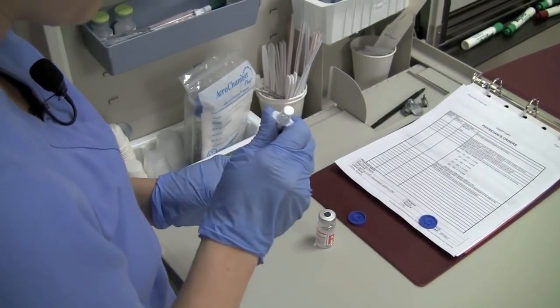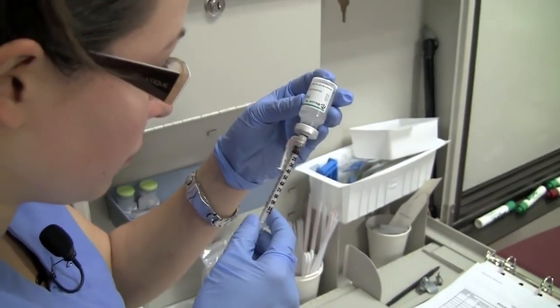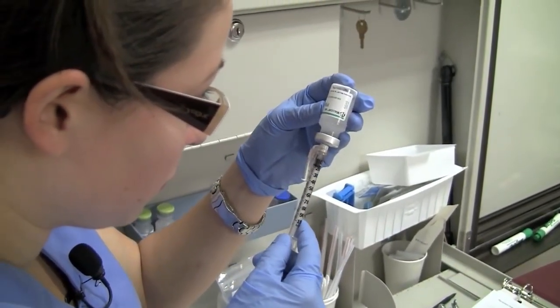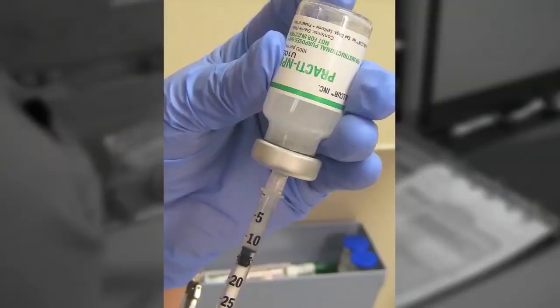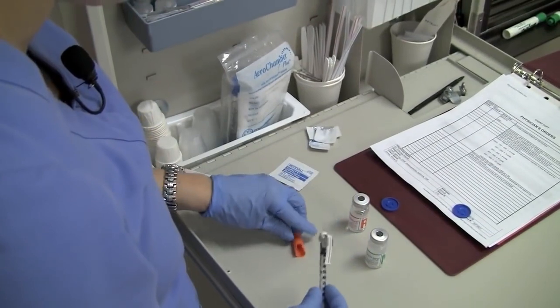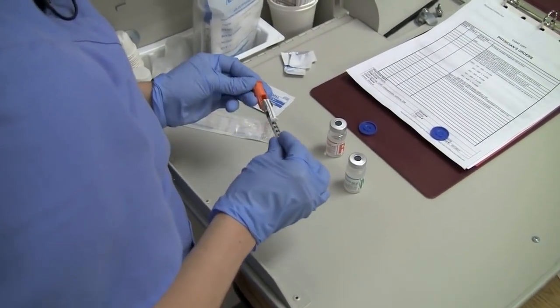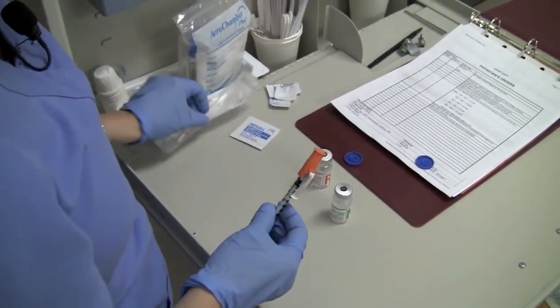Reinsert the needle into the NPH vial and withdraw 30 units of NPH. Be careful to withdraw only the ordered amount. If excess medication has been withdrawn, discard the syringe and begin again with both insulins. Withdraw the needle and replace the cap using the scoop method to maintain sterility.